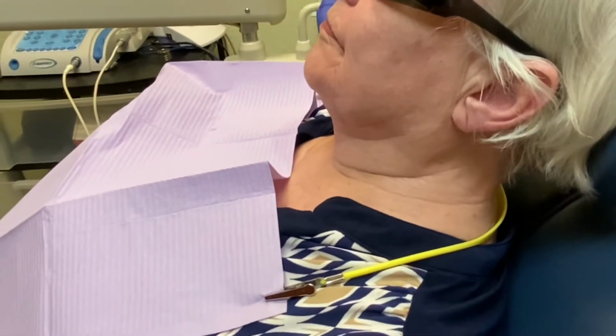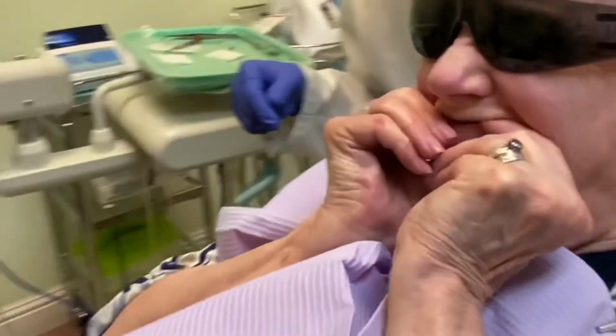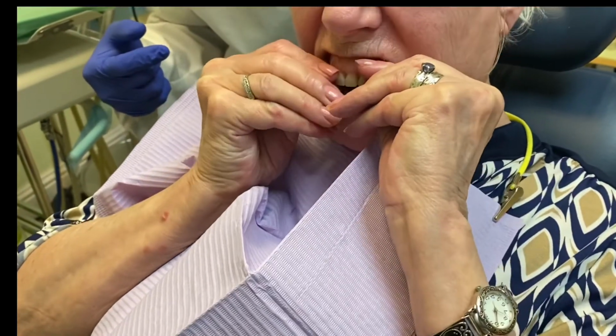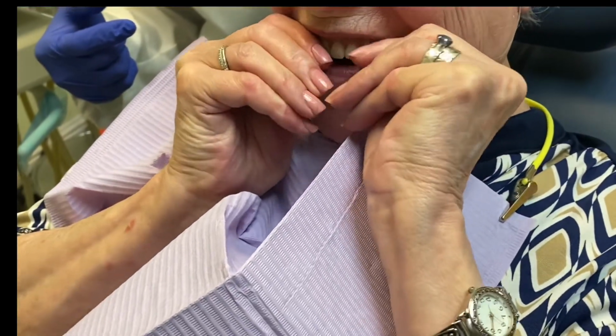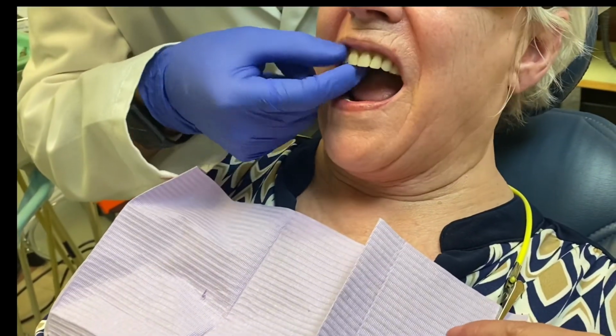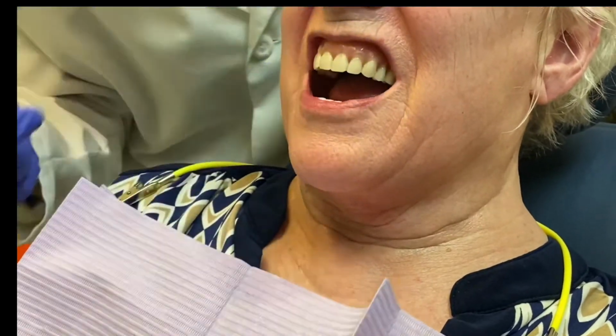Can you take it out and try it again for me? Try it on. Try it on. Is it good? Yeah. Open? A lot more stable. Uh-huh. All right. Yeah.